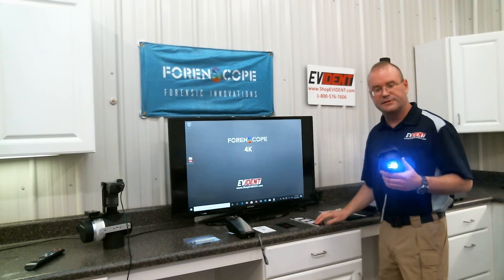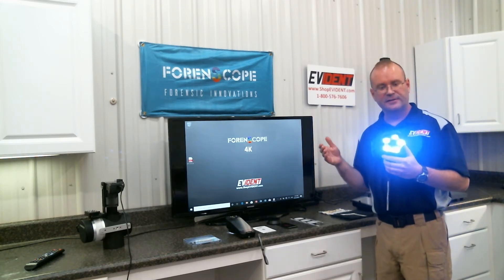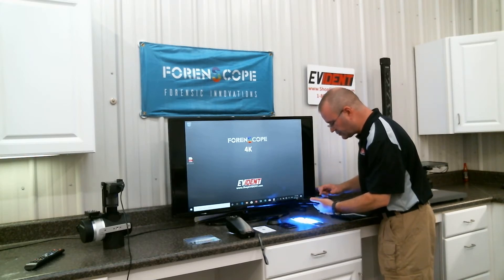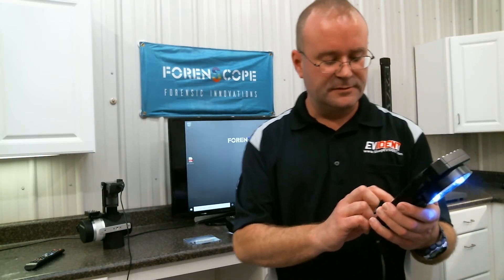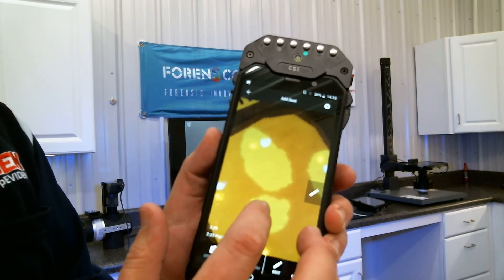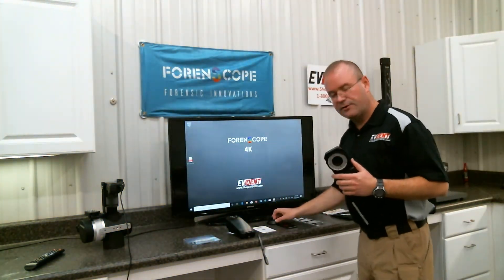It also works on body fluids. So I can remove my photo scale cap and now I've got a search tool at the scene to search for body fluids such as semen, saliva, and urine. When I search the area, the body fluids will glow. The orange filter will provide the contrast I need.